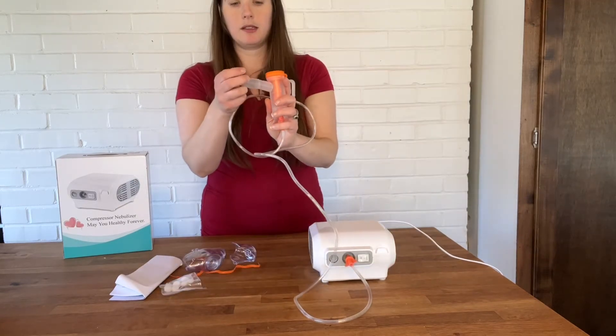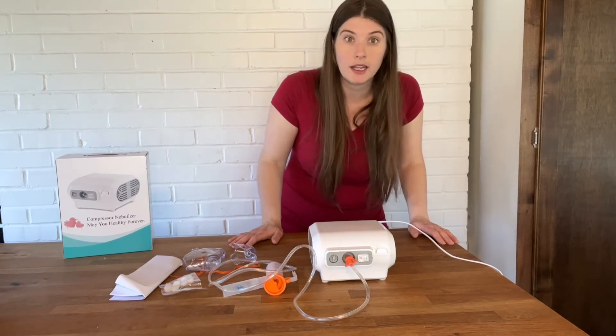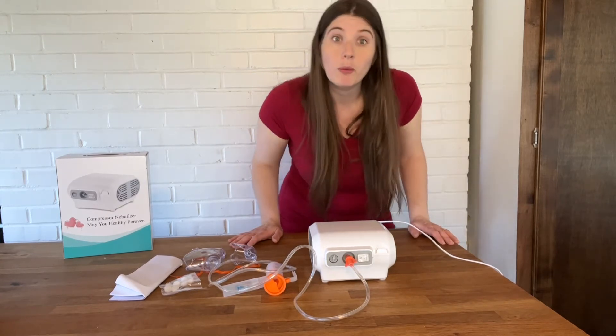We're going to use the mouthpiece. This helps with all sorts of respiratory issues — asthma, pneumonia, bronchitis — anything to help you breathe better.